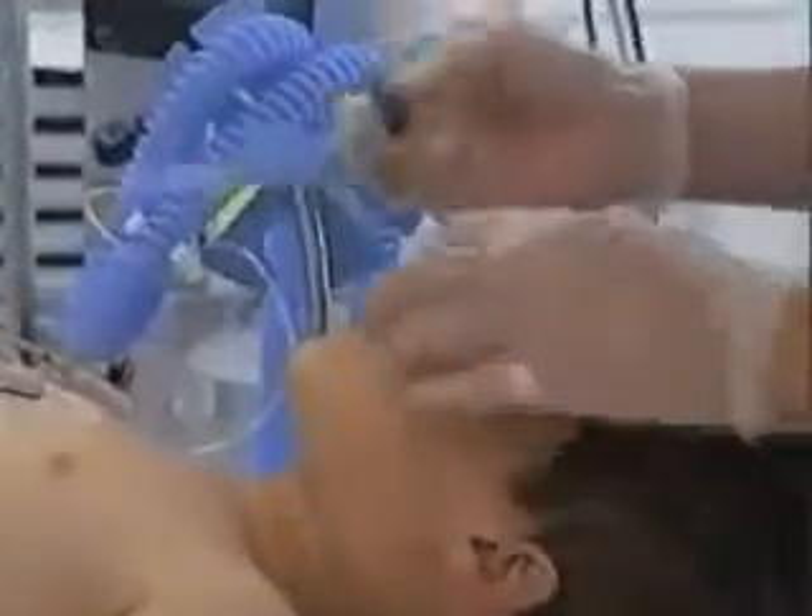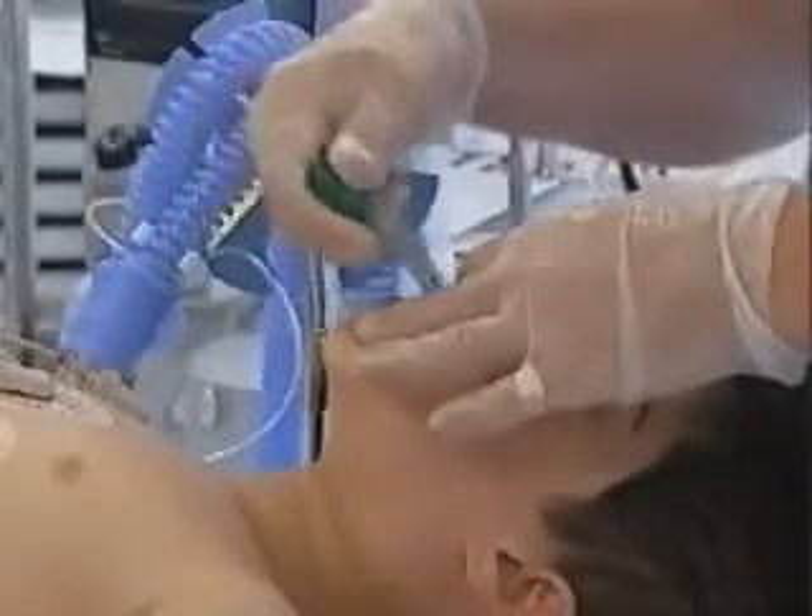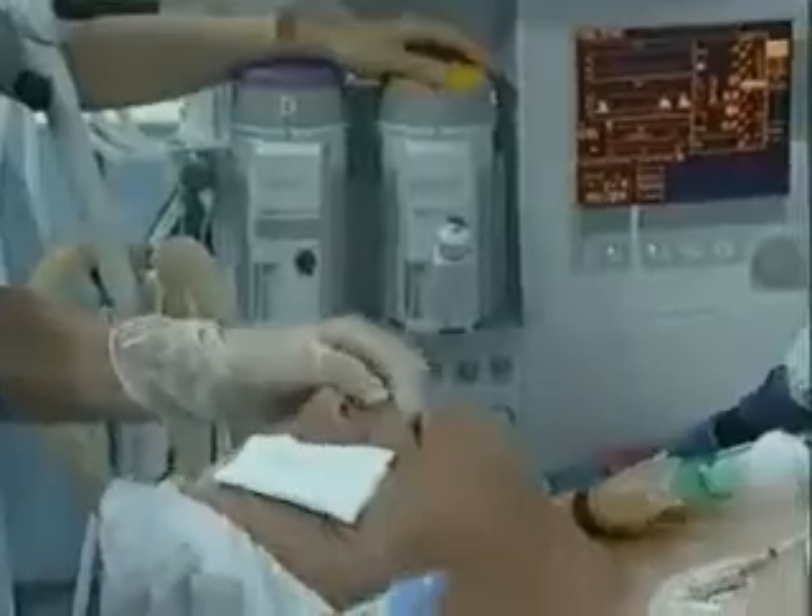The patient's head is either maintained in a neutral position or in extension. Jaw thrust can be useful.